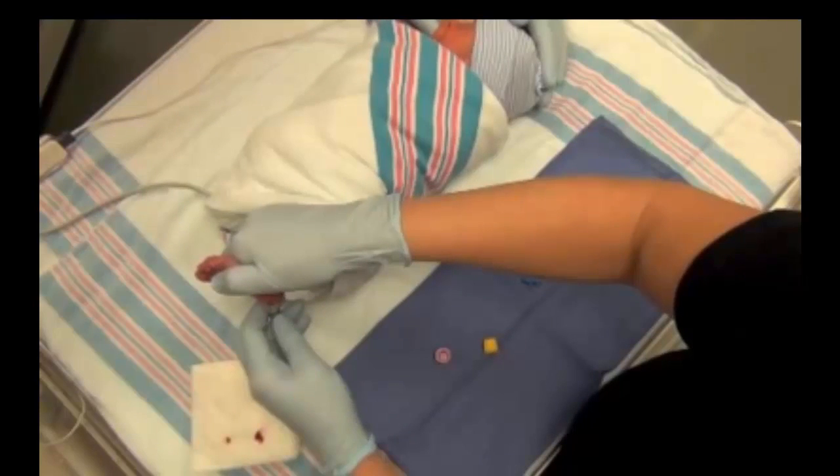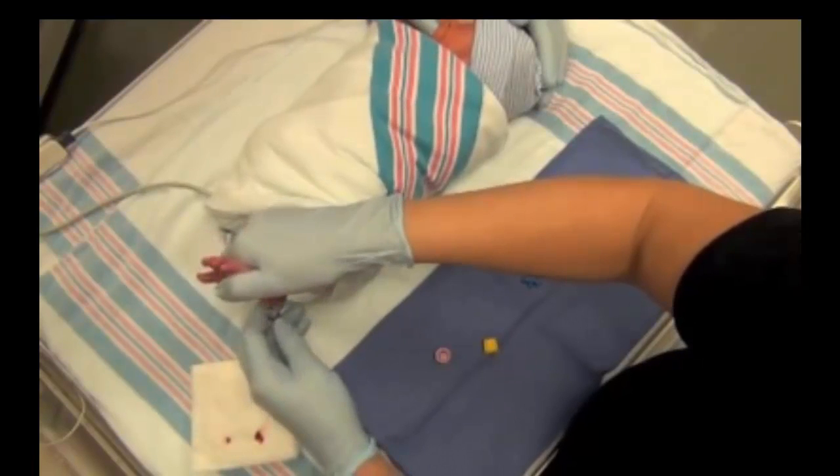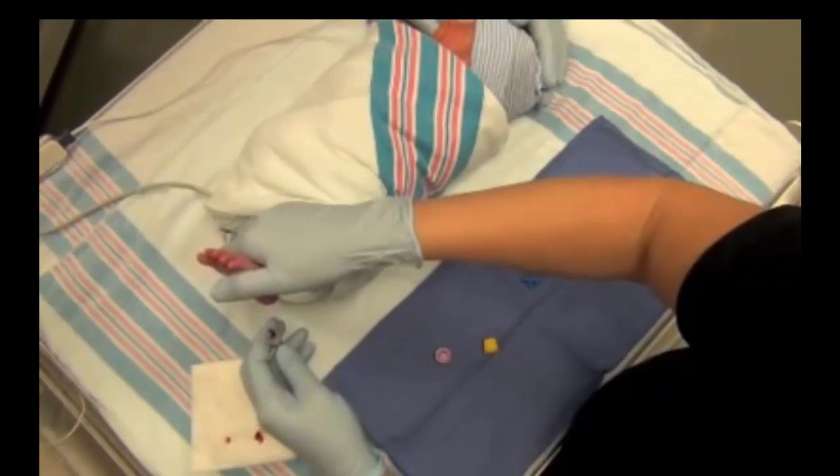Be certain not to scrape the heel with the microtainer. This will cause hemolysis and lead to inaccurate lab results.